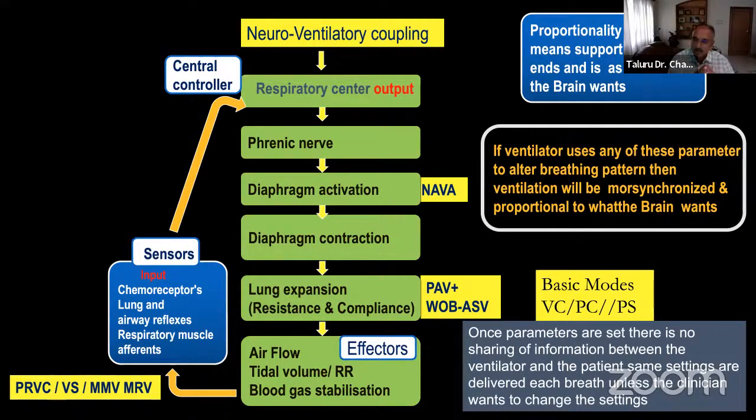In fact, there is no publication to the effect that the modes per se are changing or altering the pathology or morbidity or mortality in any disease process, because there are so many confounding pathologies. It is very difficult to isolate only a mode's contribution to survival or outcomes in a patient. So it is very difficult to study.